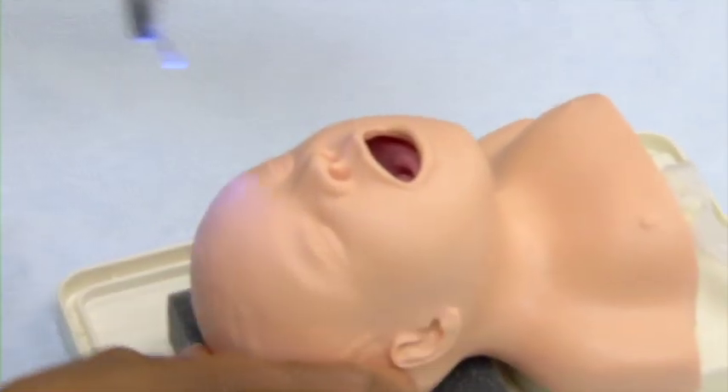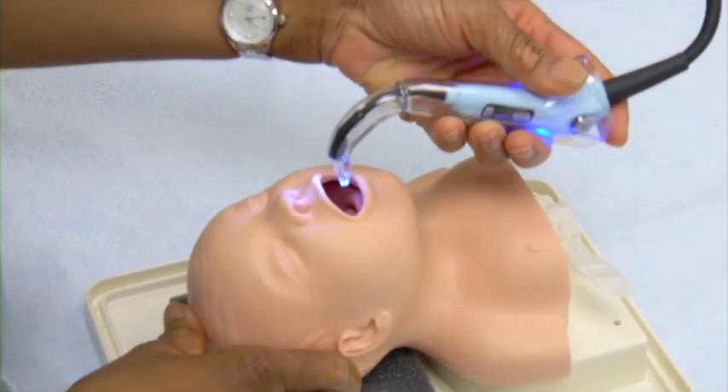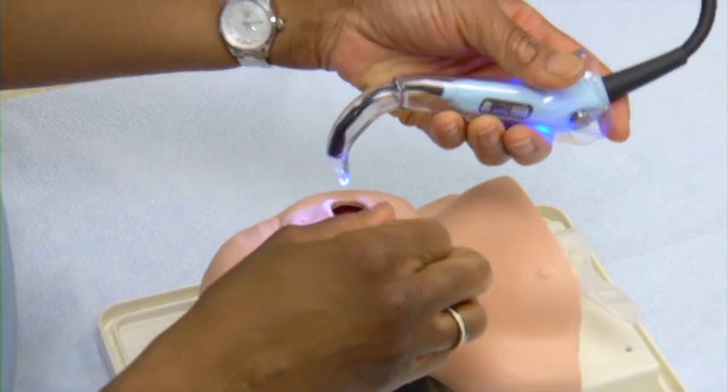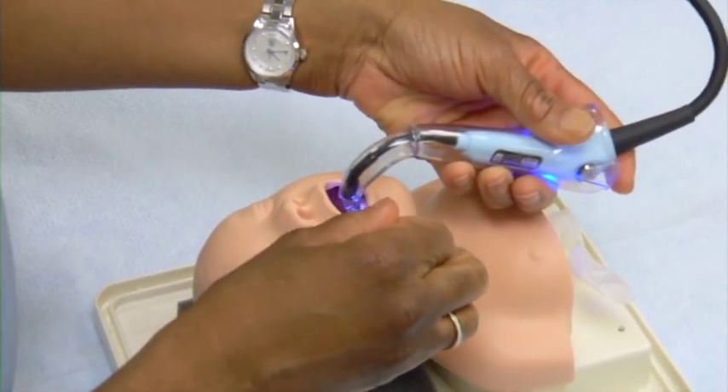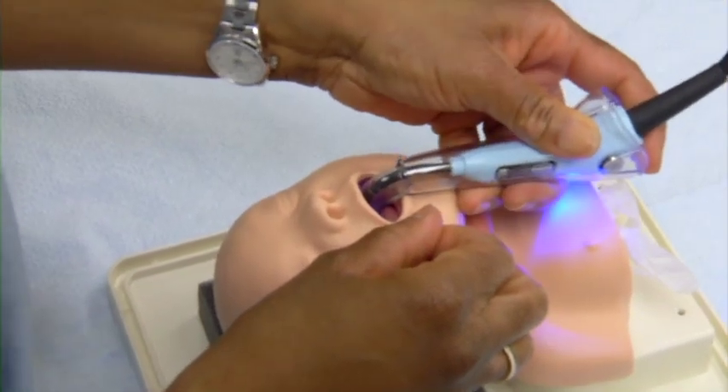Here are some tips for the infant who may have a small mouth opening. The technique is to scissor the mouth open as much as possible and to put your blade in midline without a sweep of the tongue.